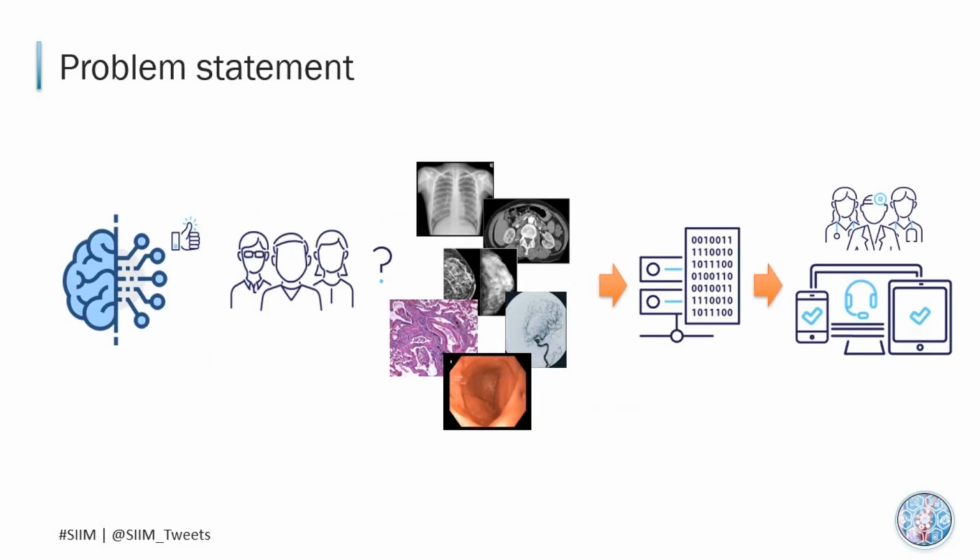And on top of that, one thing we quickly identified during the prototyping is that we can generate some AI results, but that we have no way to share them. We'd like to communicate our results back to the PACS or VNA so that the radiologist can easily leverage it. Now, a custom integration with the PACS does not sound like a good idea because we'd like to avoid maintaining different integrations for different PACS. Maybe job security, but I'd rather develop new AI algorithms than have to deal with custom integrations.